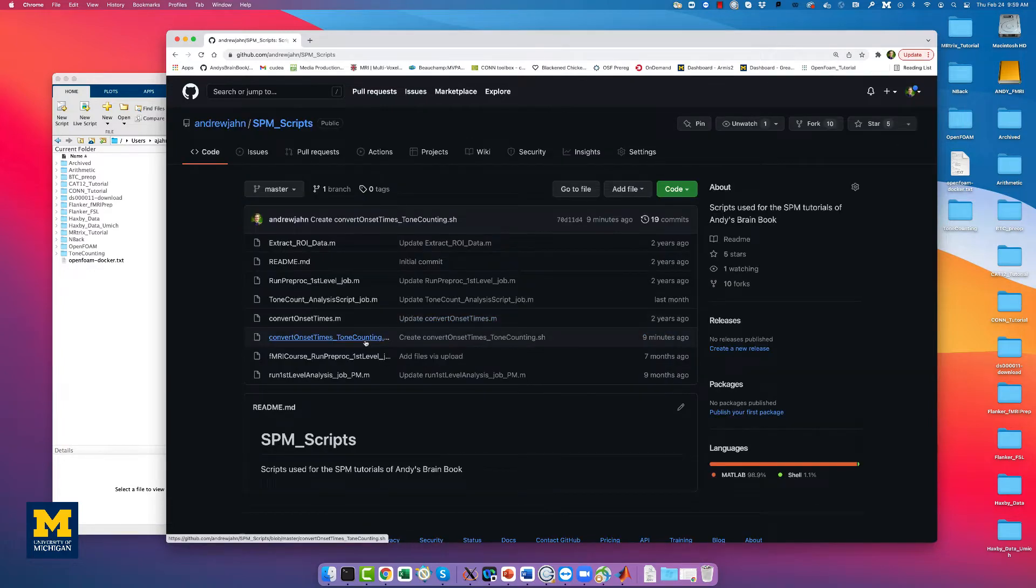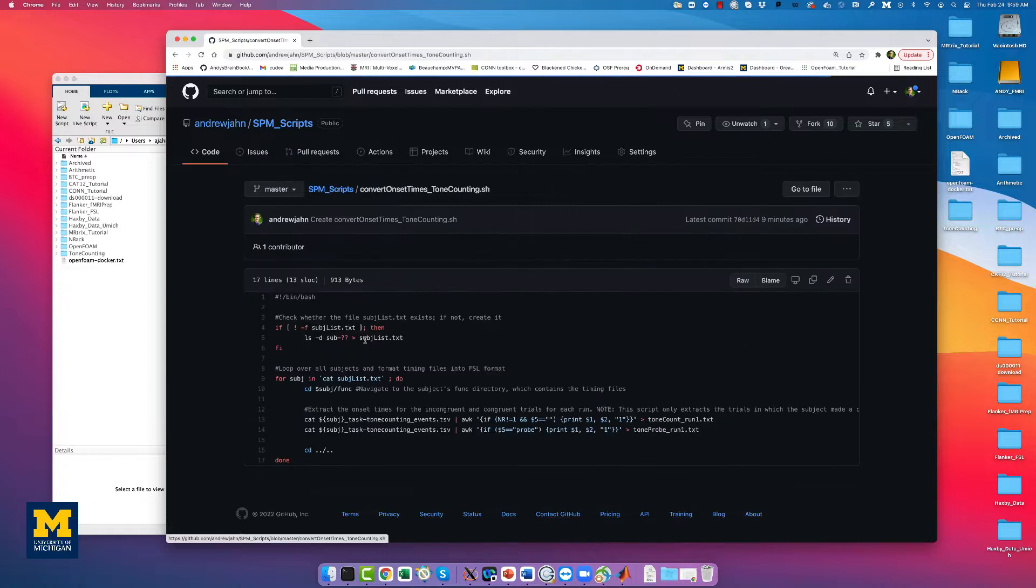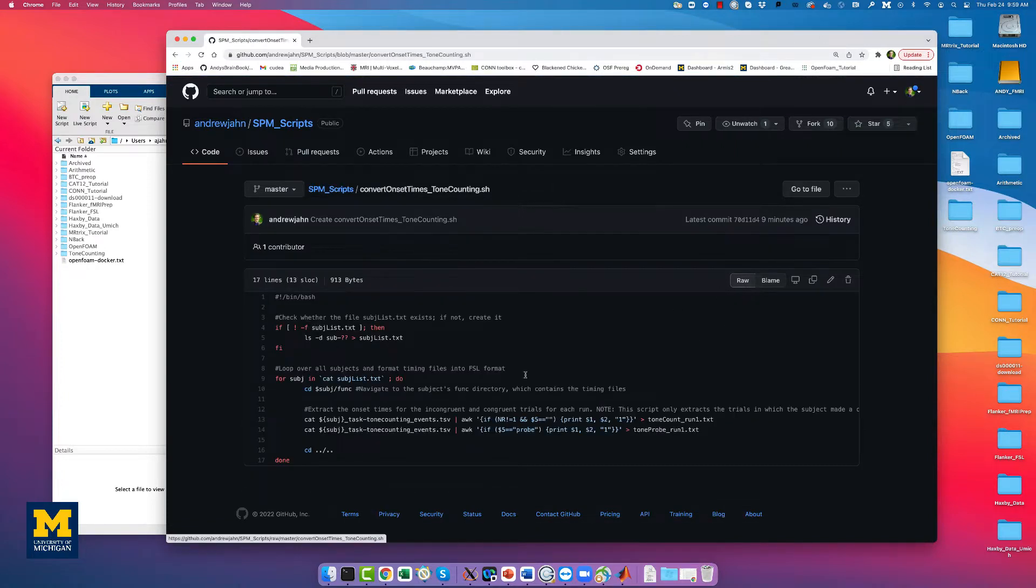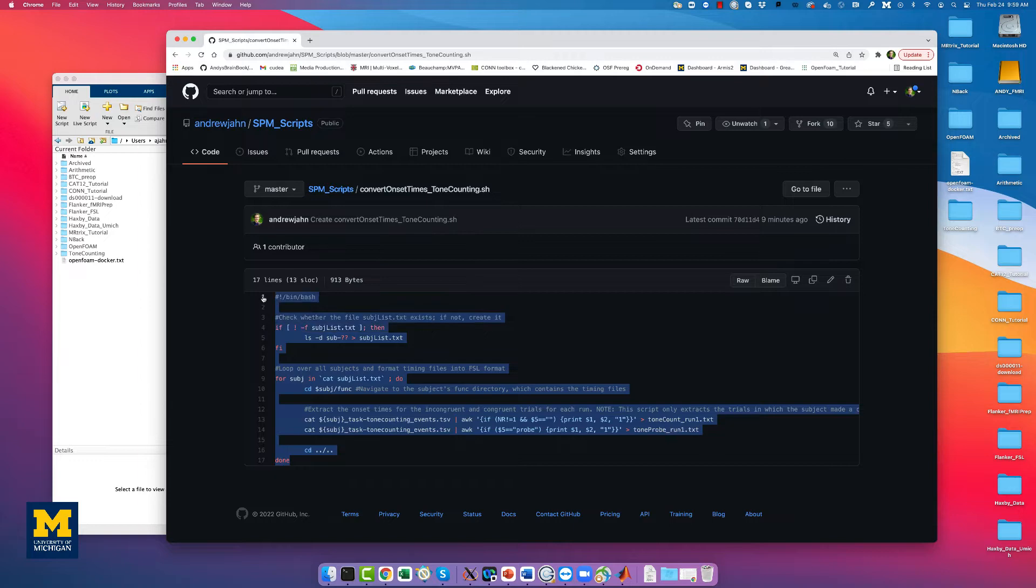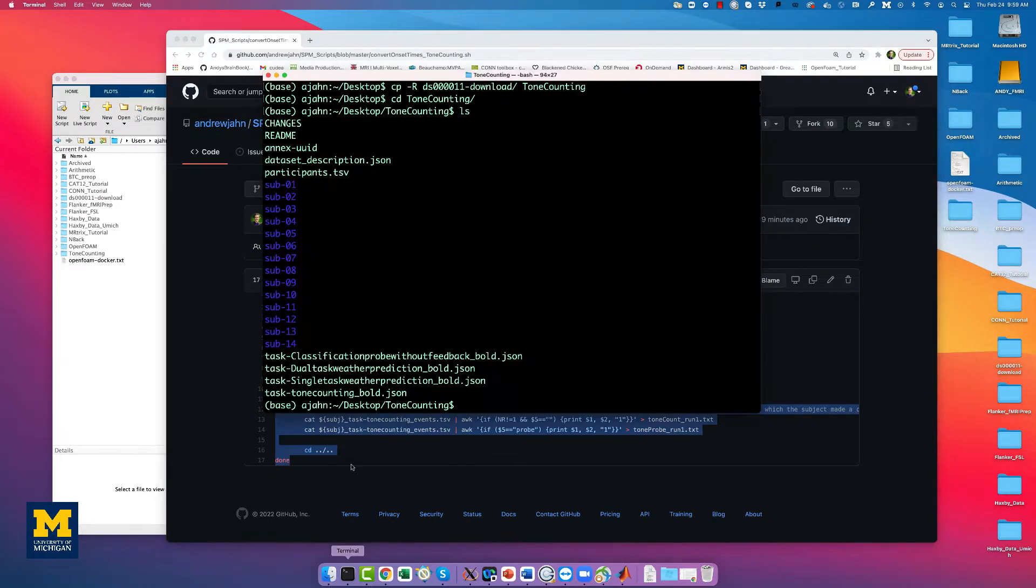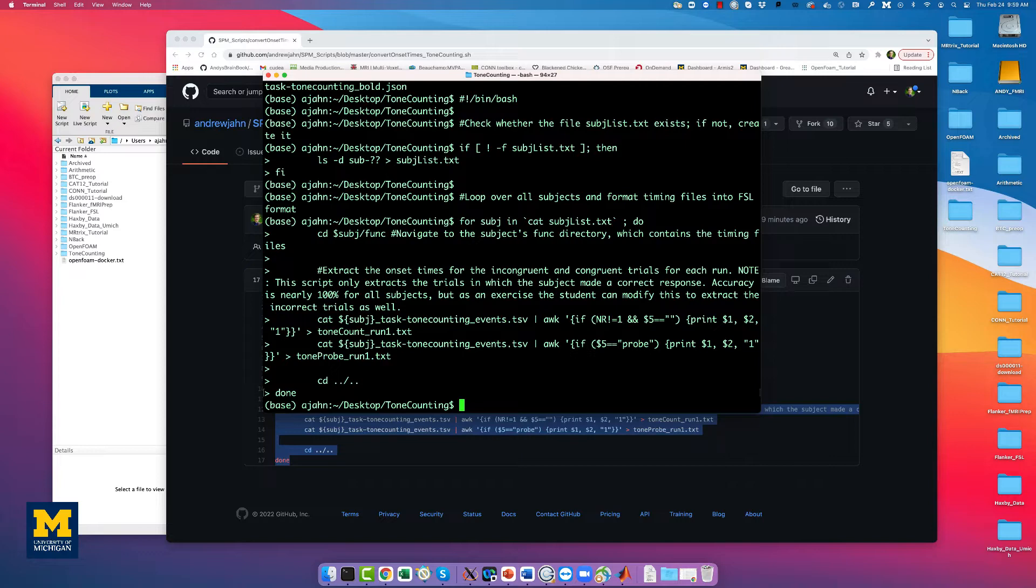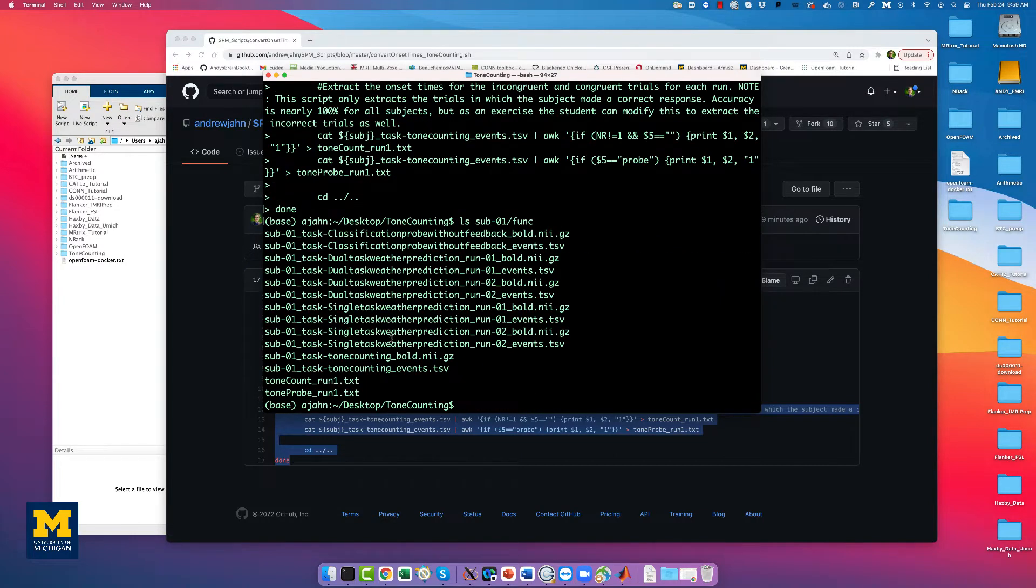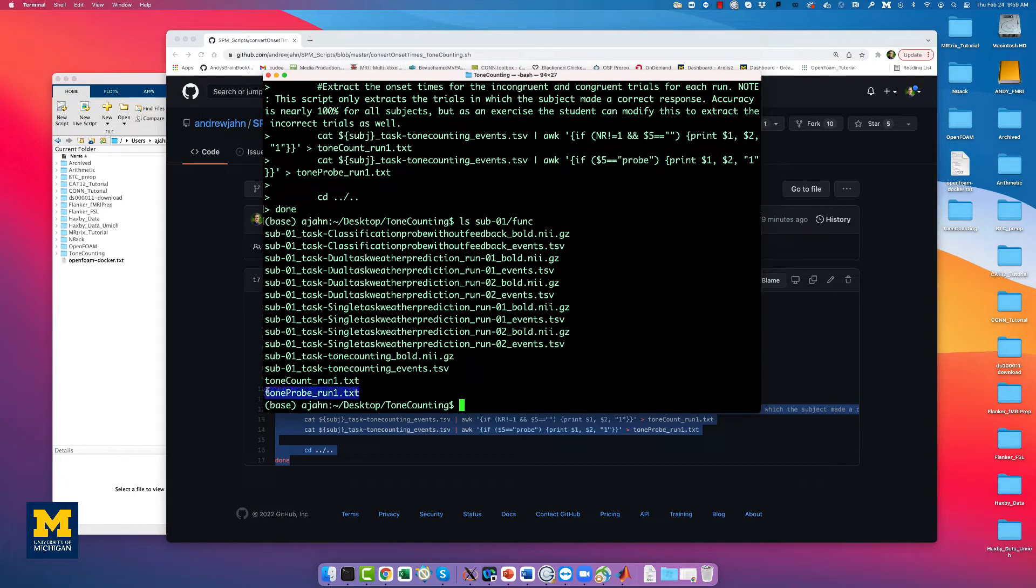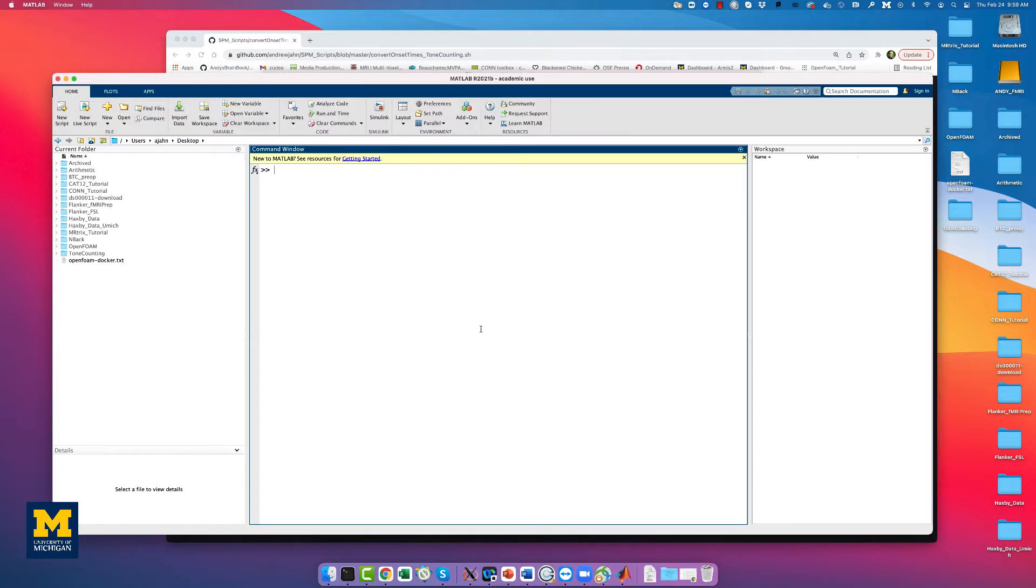Click on Convert Onset Times Tone Counting and either download it with the raw button or simply copy and paste it into a terminal provided you are within the tone counting directory and press enter. This will create two new text files, Tone Count Run 1 and Tone Probe Run 1, containing the onsets for each condition.